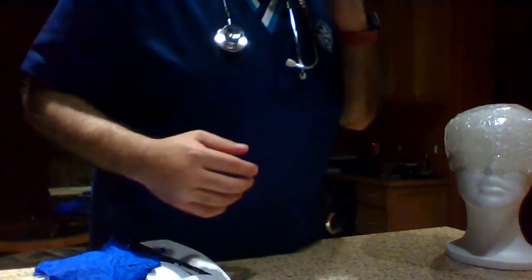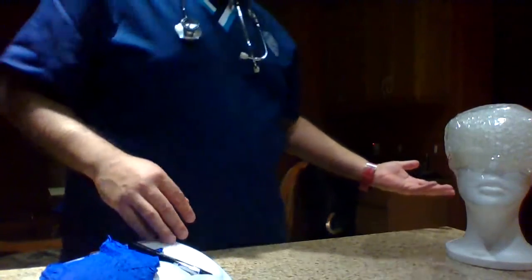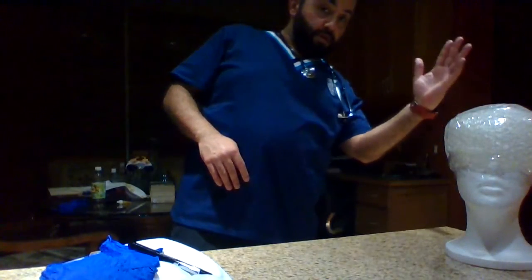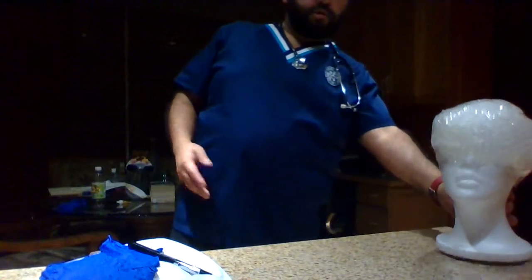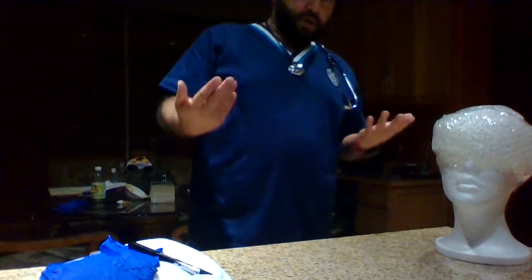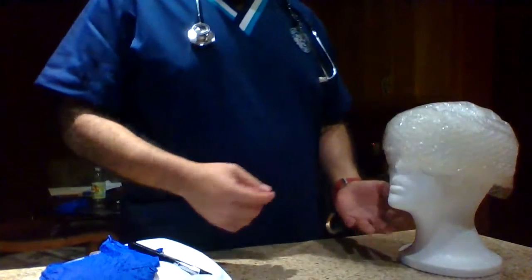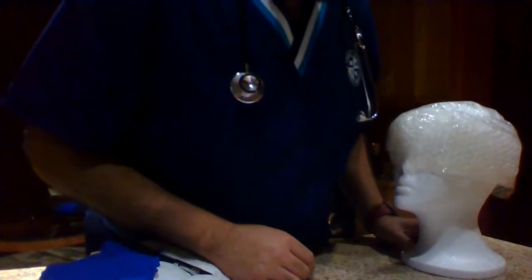So next, we're going to place the patient in the high Fowler's position, which means their head is elevated, and you move the bed to a more comfortable height for you. So it'll be up here. For me, this would be the patient height and be more comfortable for me.